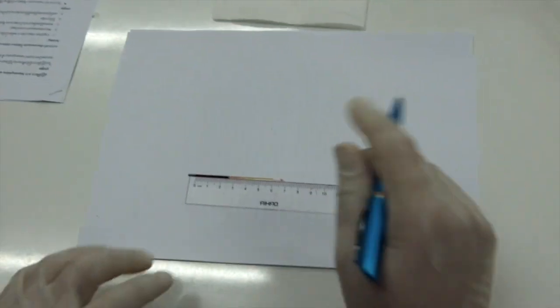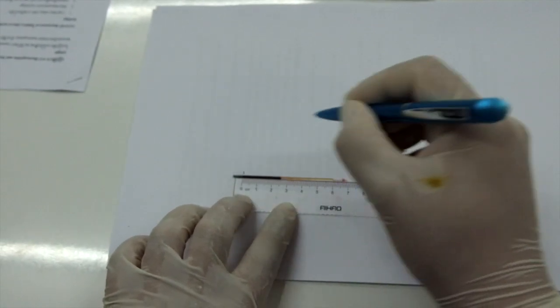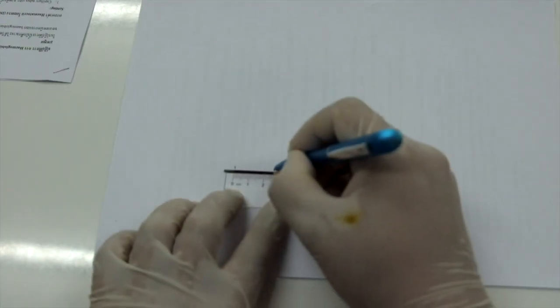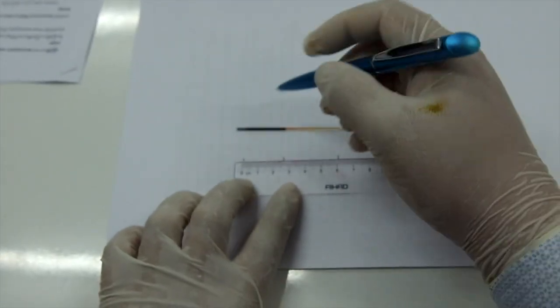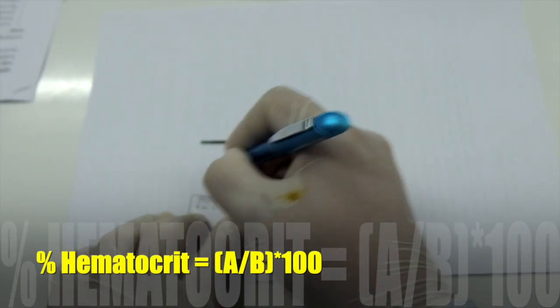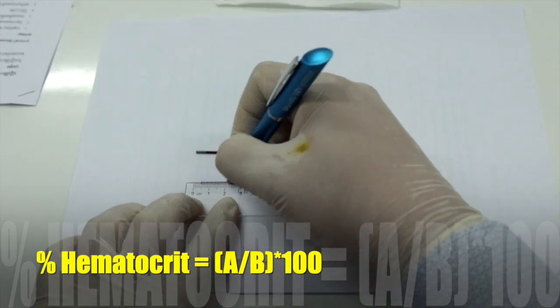Determine the spun tubes by which the total length of the blood is assigned as B and the length of the red pack is assigned as A. Therefore, the percent of hematocrit is equal to A divided by B and multiplied by 100.